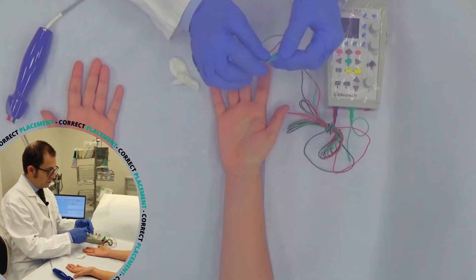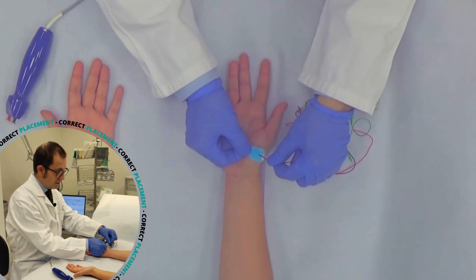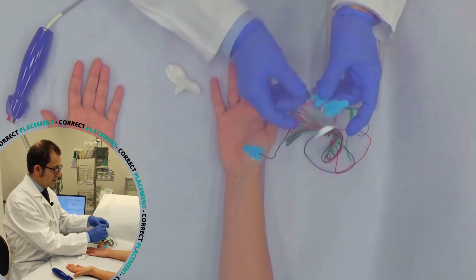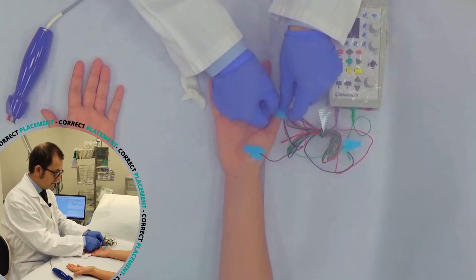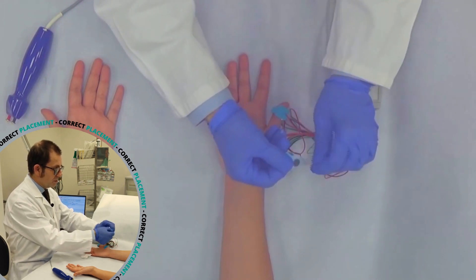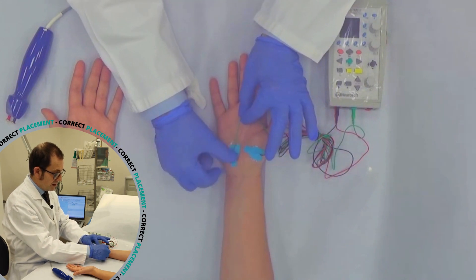Then we have to take the cathode, and the cathode must be put on the muscle belly, then the anode on the proper tendon of the muscle, and the ground — when it's possible — between the stimulator and the active cathode electrode.